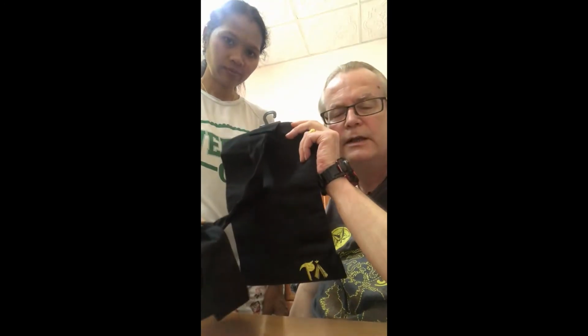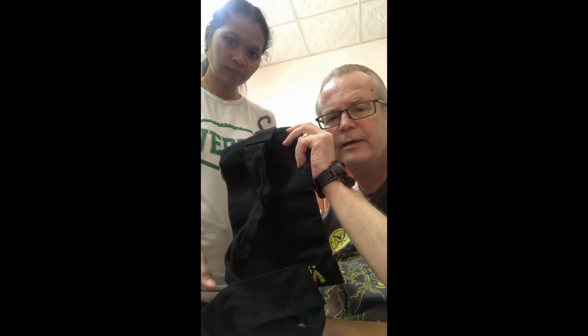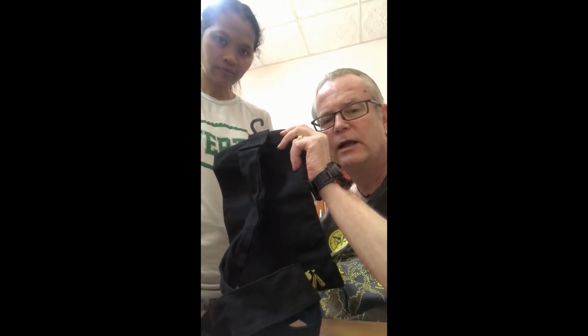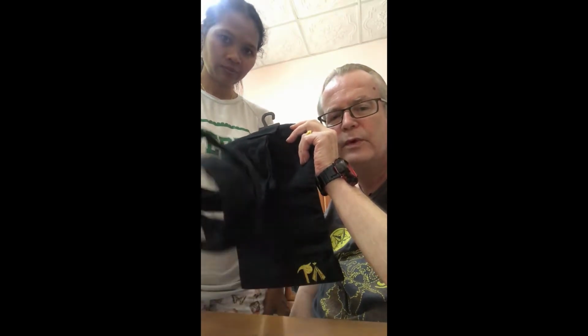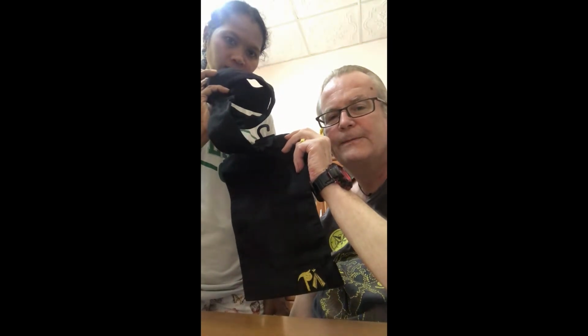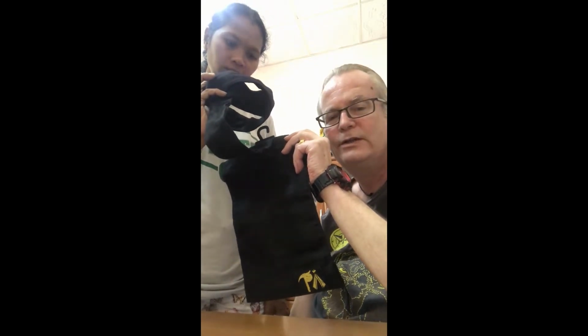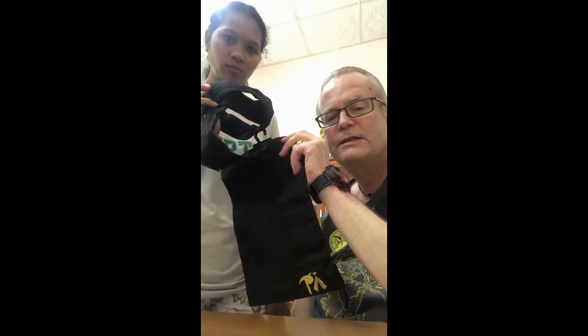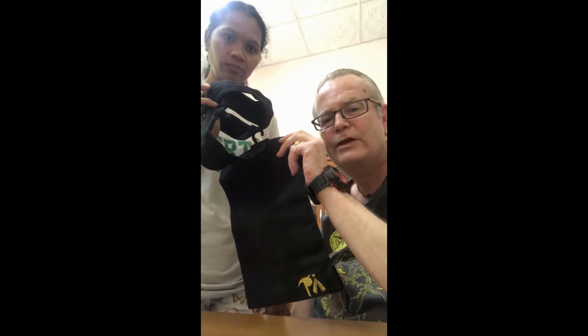So what we've got here is the TP bag catheter bag cover that we design, manufacture and sell. But if you wish to copy this design, you're more than welcome to do so. I can't sew, so all I can do is give you some idea of the things to take into consideration when you do decide to make your bag.